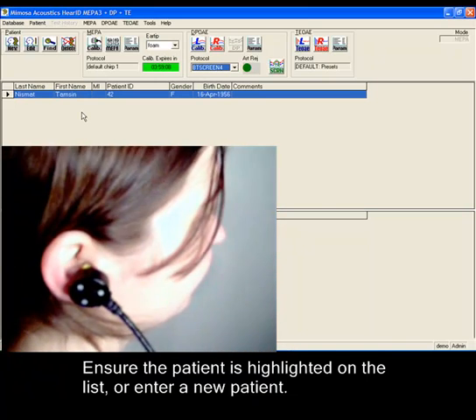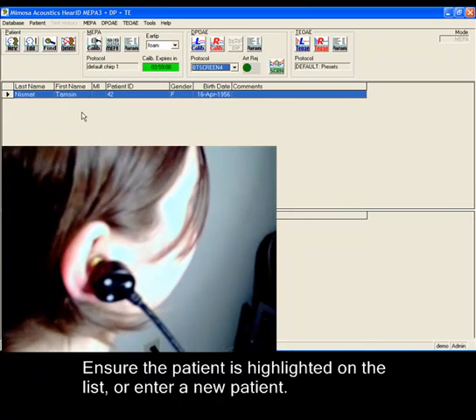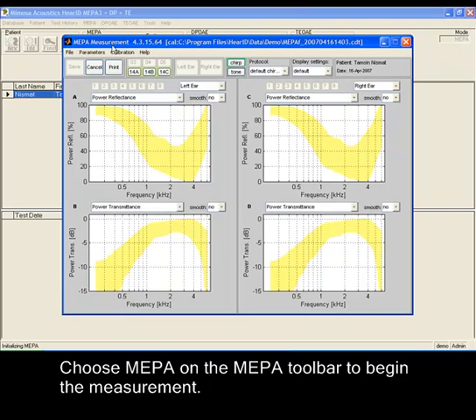Ensure the patient is highlighted on the list or enter a new patient. Then choose MEPA on the MEPA toolbar to begin the measurement.